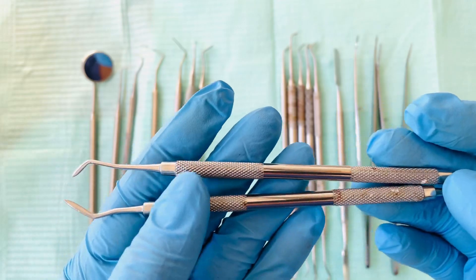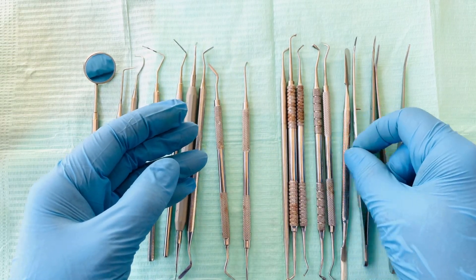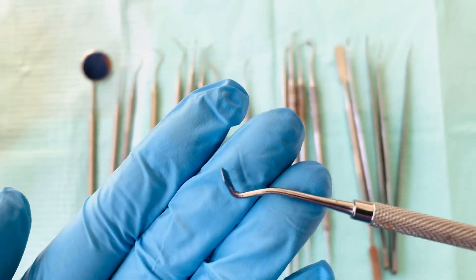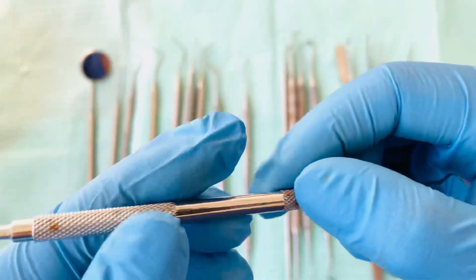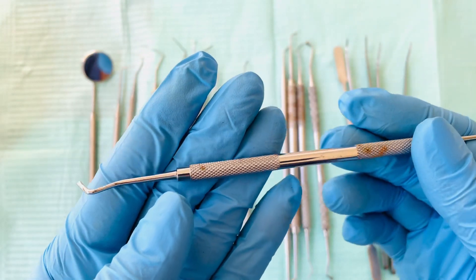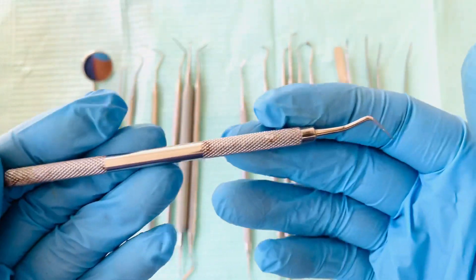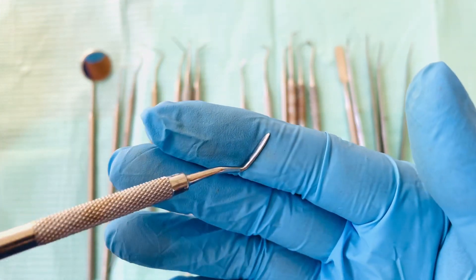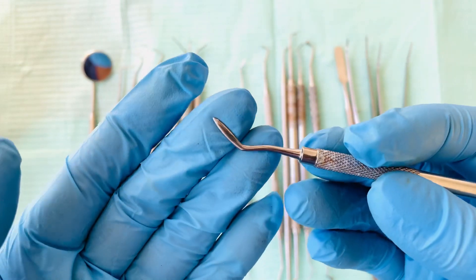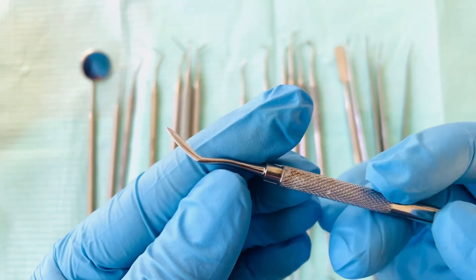This one is actually called a Hollenbach carver — it's another type of amalgam carver. The longer amalgam carver can also be used as a gum separator. A gum separator is an instrument used when clinicians are doing an extraction — they have to separate the gum from the bone first, so they can use this one as a gum separator.